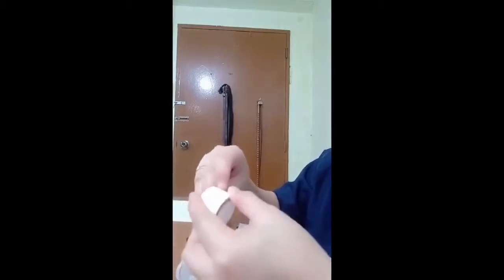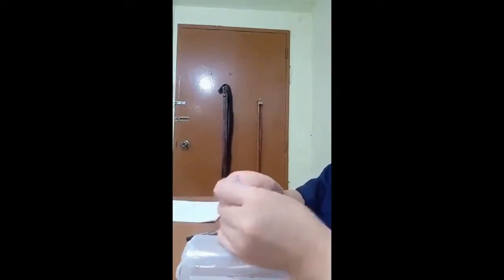So we're just going to attach it to the IV fluid. Okay, so it looks like this.